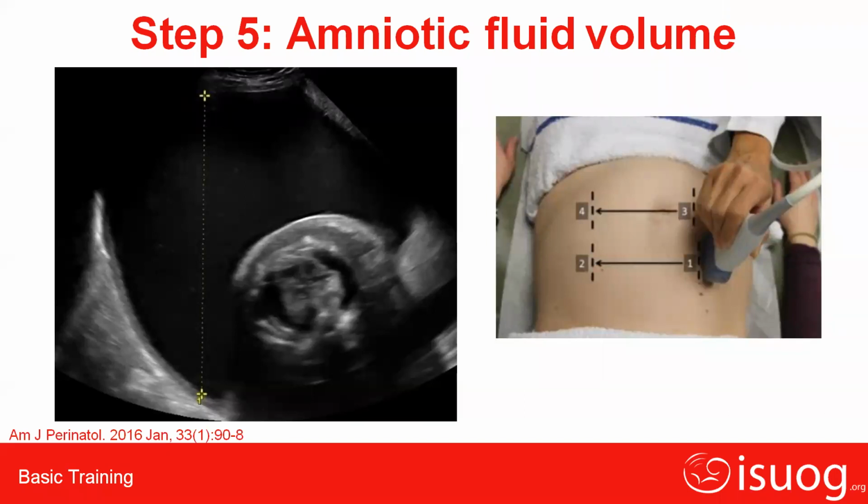Yes, Professor Khurana wants to say something, please. Yes, what I was mentioning was that when we assess for oligoamnios and we have excluded leaking, the next most common cause, of course, is placental insufficiency and growth restriction. And we must also look for, as mentioned already, urinary anomalies, either renal agenesis or an obstructive uropathy in the urethra or bladder.